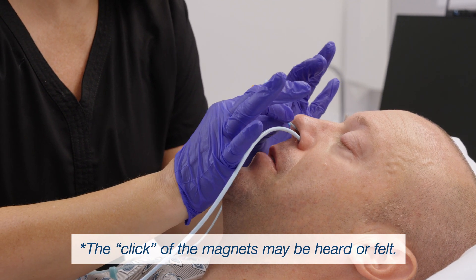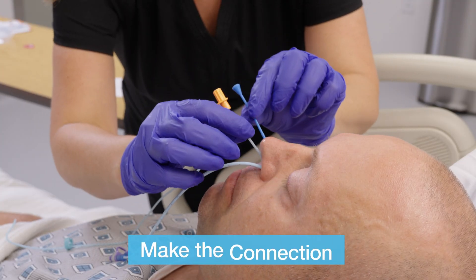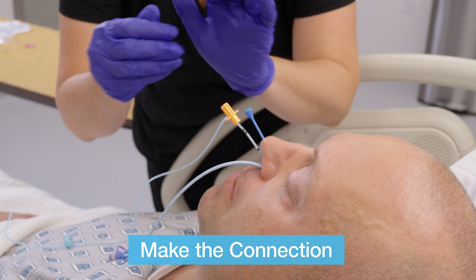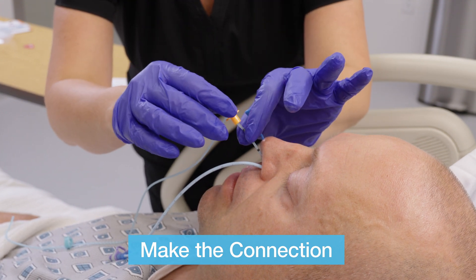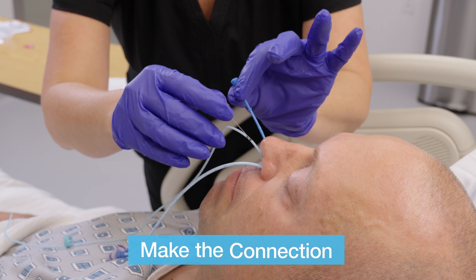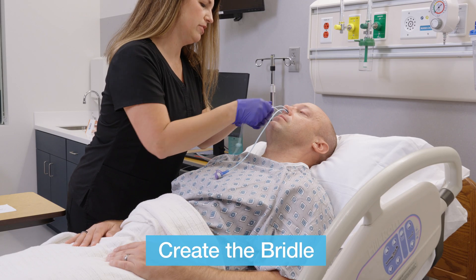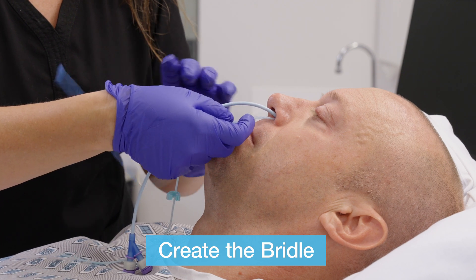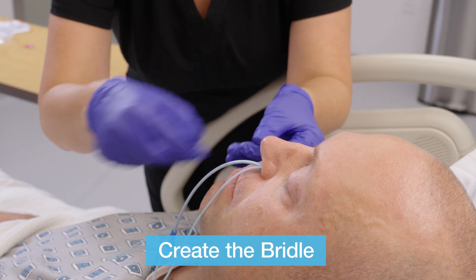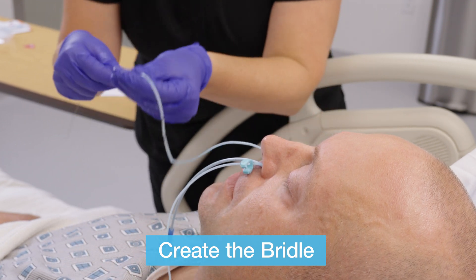It may be necessary to gently twist the probes or move them up and down to encourage contact between the magnets. If no contact has occurred, then advance both the bridal tubing and the probe. Once contact has occurred, slowly withdraw the probe and allow the bridal tubing to advance through the nose. Continue until the two black markings on the bridal tubing are completely pulled up and through one nostril, and at least a couple inches outside the opposite nostril. This creates a loop, or bridle, around the vomer bone.